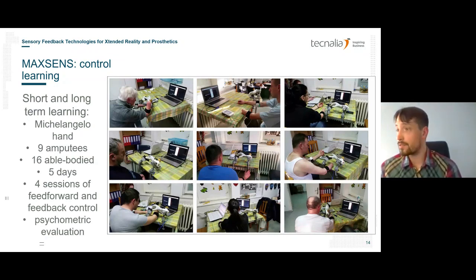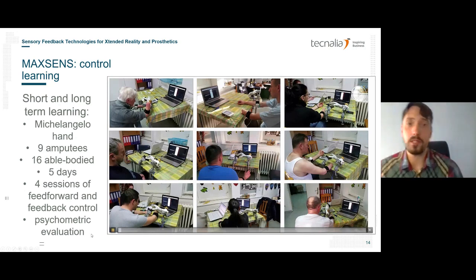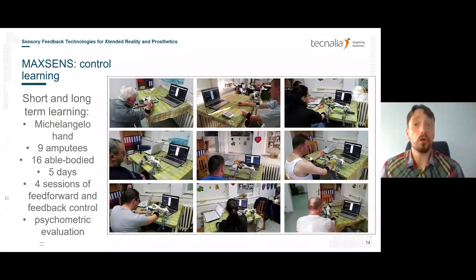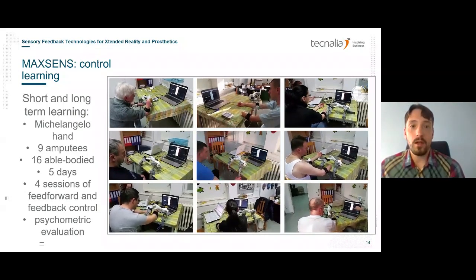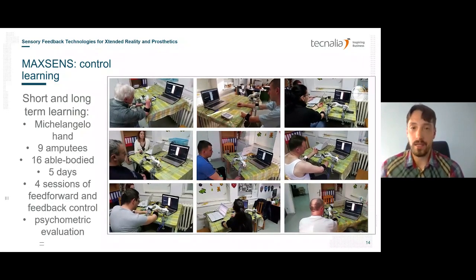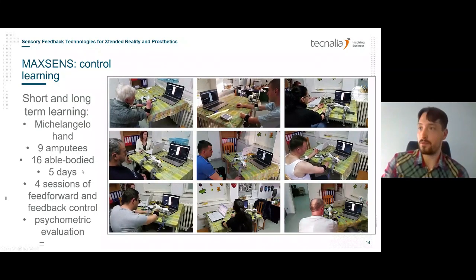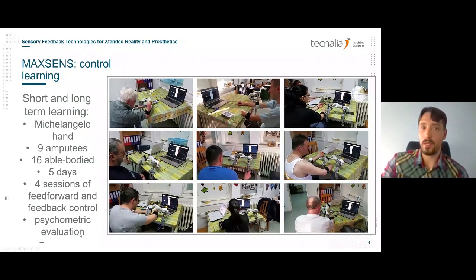You can see here a video from the study that we did on 9 amputees. It was a longitudinal study. It consisted of four sets of 60 grasping sessions over 5 days. And I will explain in the results how this was defined. So let's move to the next slide.